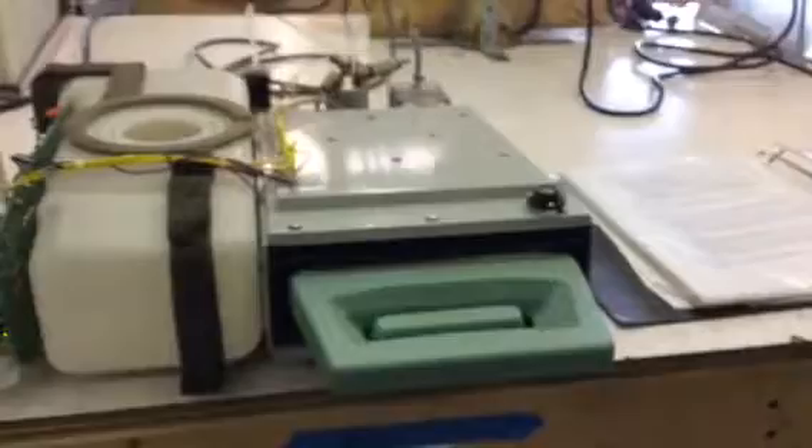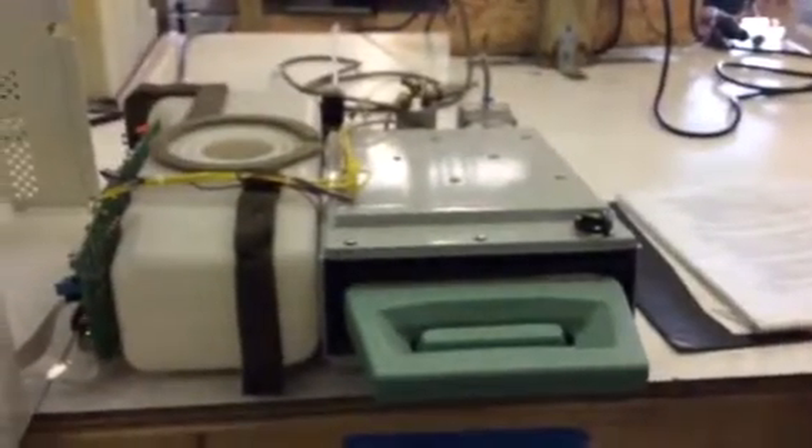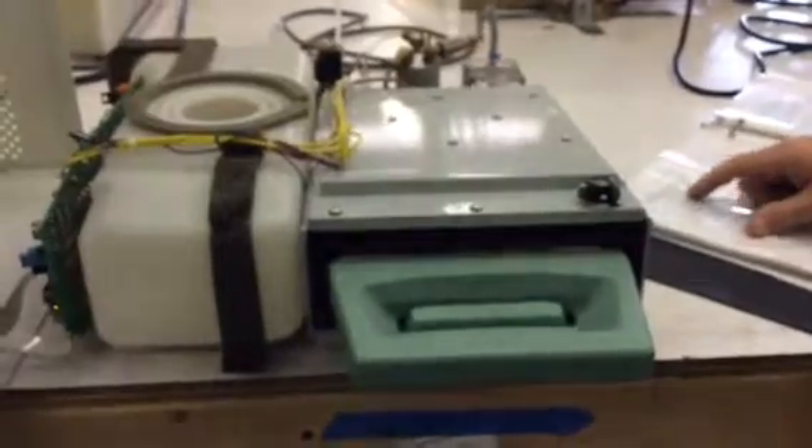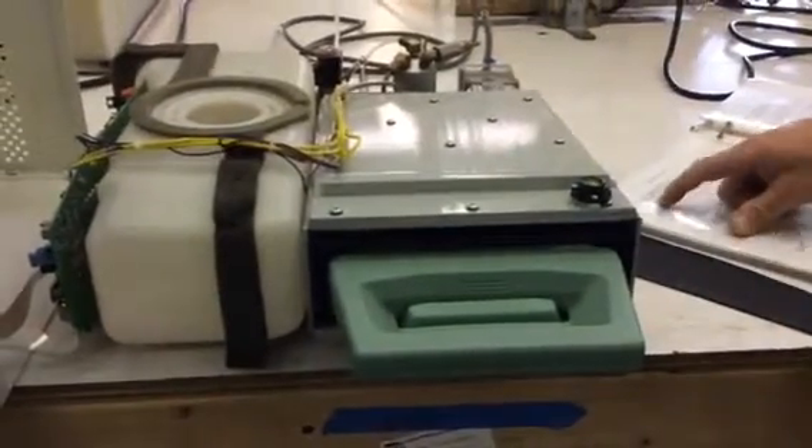We're here at Sterilizer Otoclave Solutions. We have a STATUM 2000 that was sent in from Texas recording a cycle fault 7. This machine was sent to us for preventative maintenance and repair. Right now we're going to go over cycle fault 7. Cycle fault 7 is the cassette temperature has dropped 4 degrees Celsius below a set point.